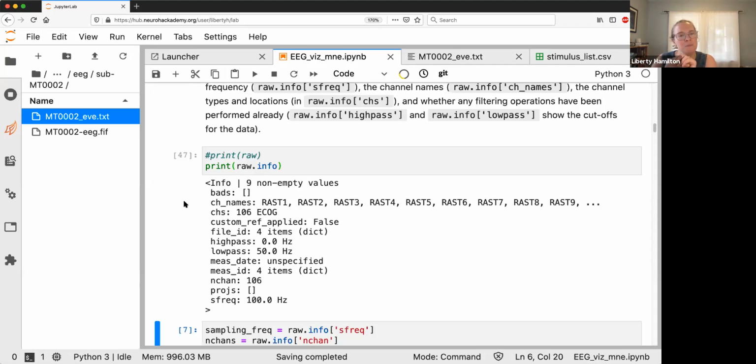I don't do this as much myself, and this is my personal opinion, but I believe the results more from an EEG localization if it were on the person's own brain than on a projection to a standard template. Not that you can't do it.